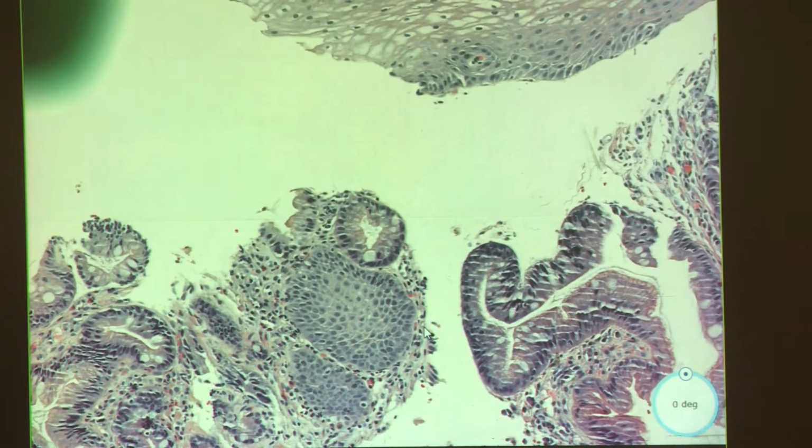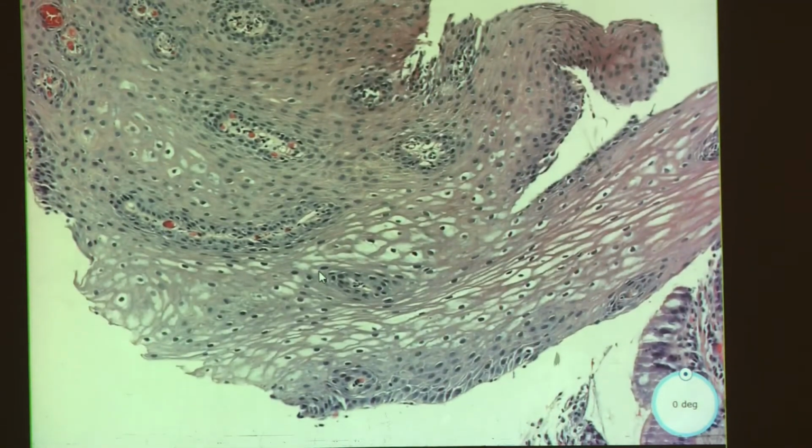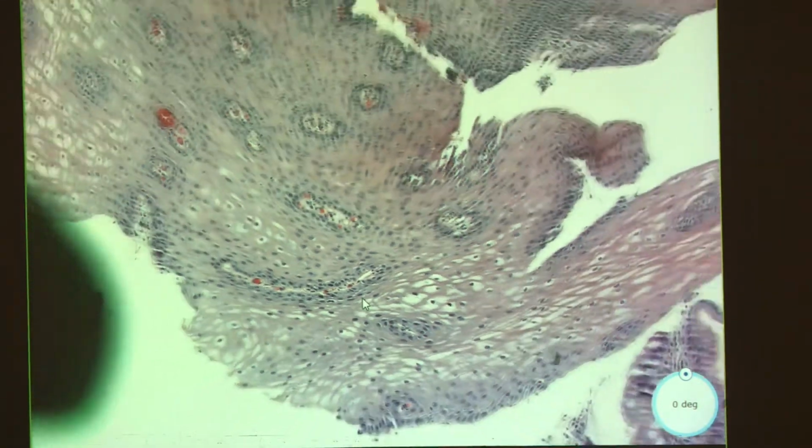So you would say intestinal metaplasia negative for dysplasia, and then you would add a note. You have to correlate with endoscopy because you can only call it... okay, I know where you're going with the note, because this is drilled into us. Dr. Willis drilled this.